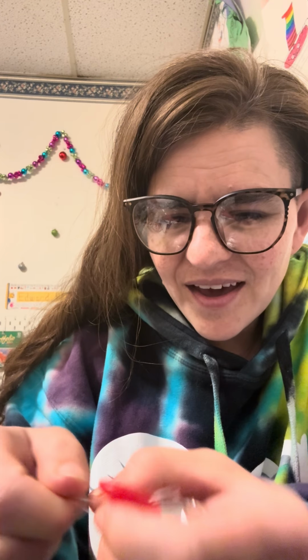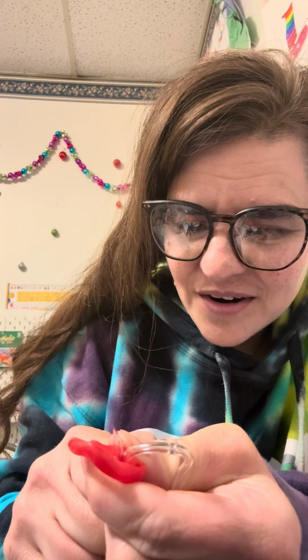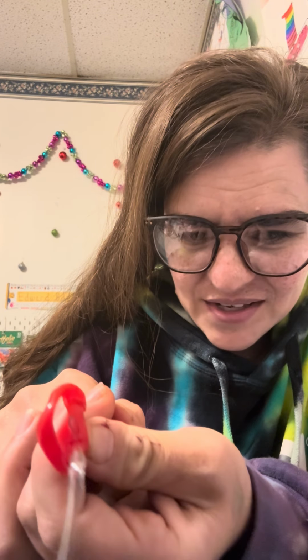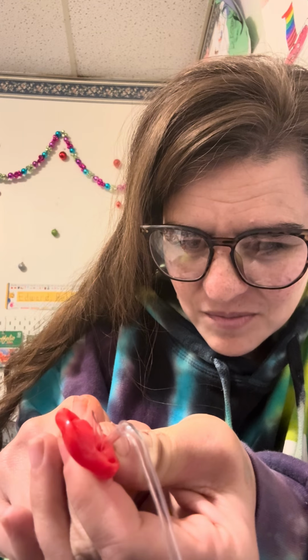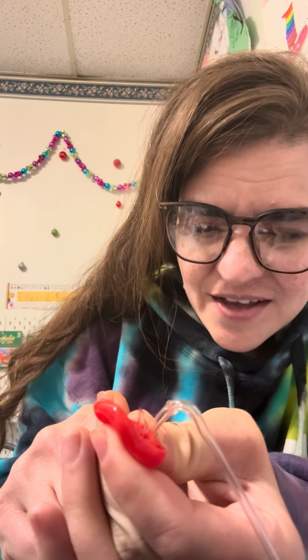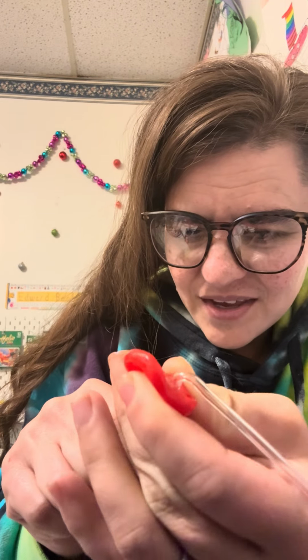Oh, yeah. Keep pulling it, and don't worry, you're not going to pull too hard. It's not that hard to pull it. I'm just doing it slow for you guys. Now just pull, pull. You see it going through? Pull it till that loop, the pointy part is all the way in. Yeah. Now, it's in. You've threaded it.